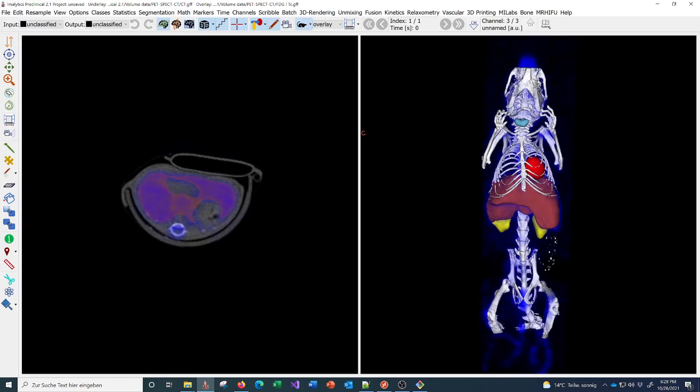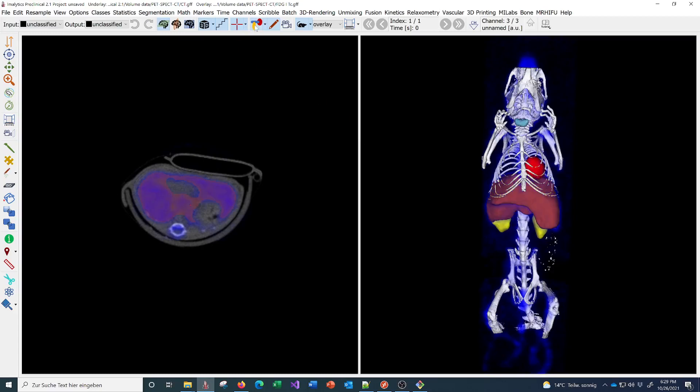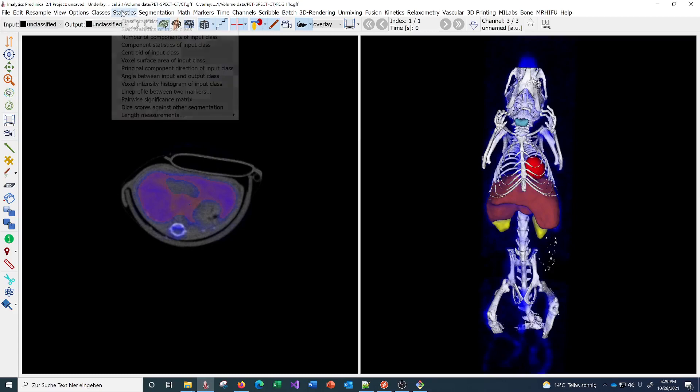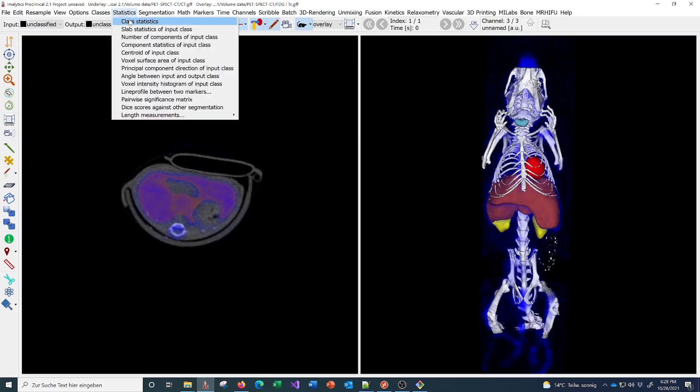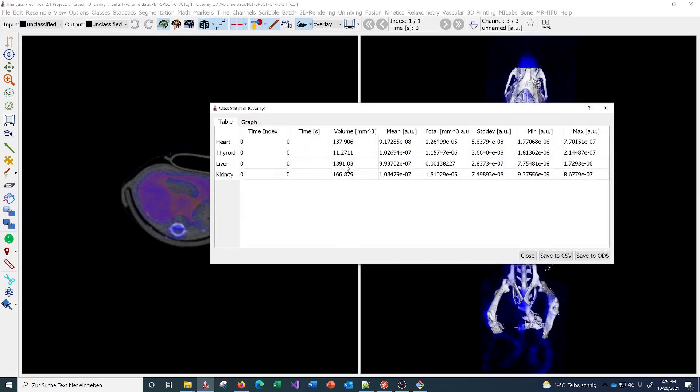With the software you can load data from multiple modalities, generate segmentation like this, then quantify the statistics. You get the values for the segmentation, the volumes, and the uptake, for example.